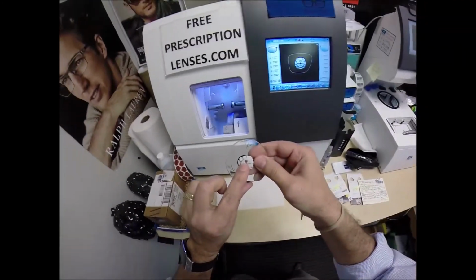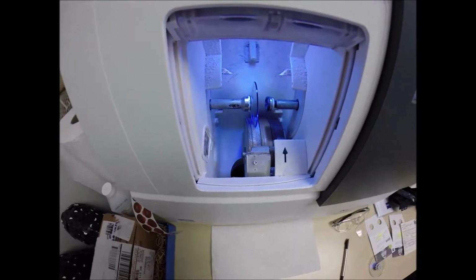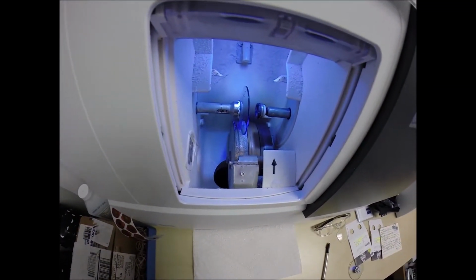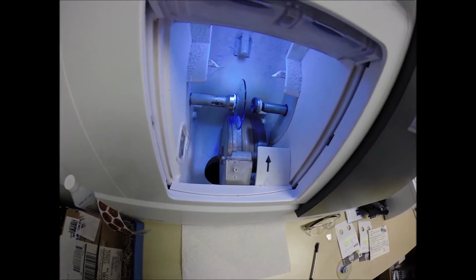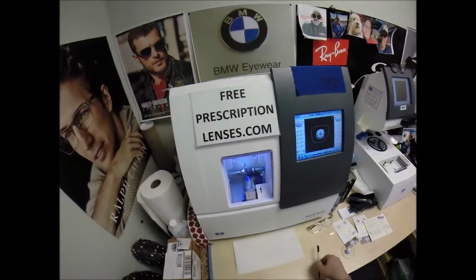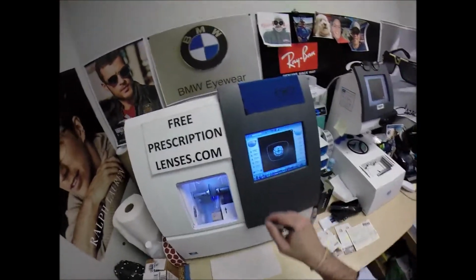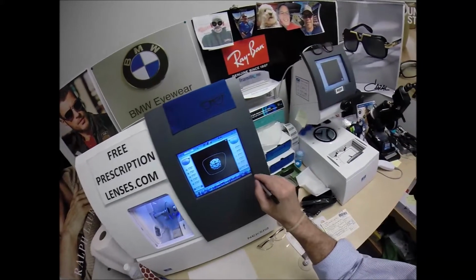Now the magnet's going to do its job its second time. It's going to attach itself to another magnet there in the chuck, or by now you know I like to call it the Charles, because I just don't know this machine well enough to call it Chuck. And I'm going to keep telling that joke until everyone, all 330 million people in this country, send me $1. Then I'll come up with a new joke.